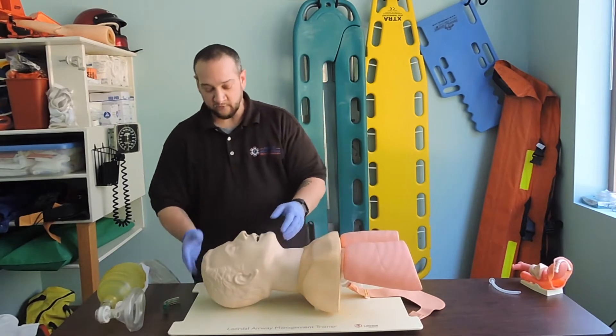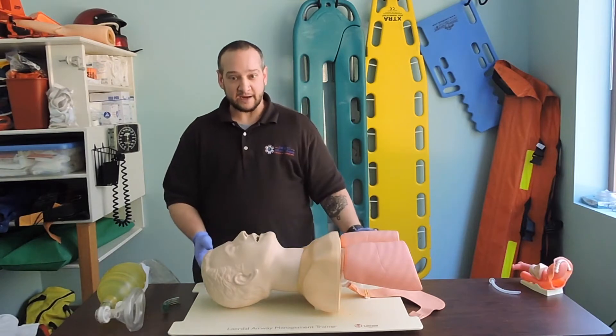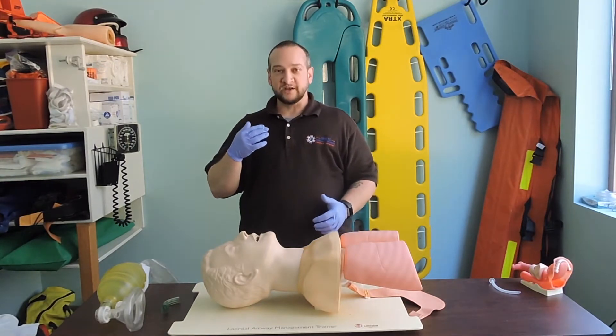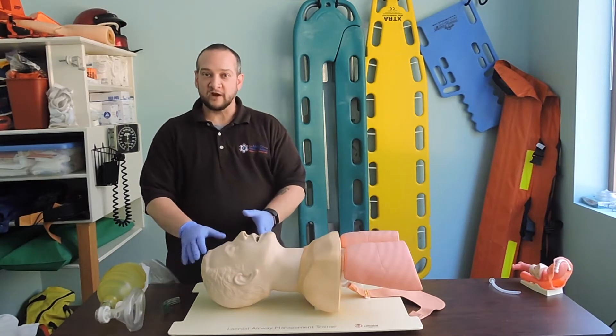If we have a patient with suspected trauma to the C-spine — to the head, neck, or back — we don't want to grossly manipulate them. We don't want to cause any flexion or extension that could exacerbate that injury. So what we want to do is what's called a modified jaw thrust.